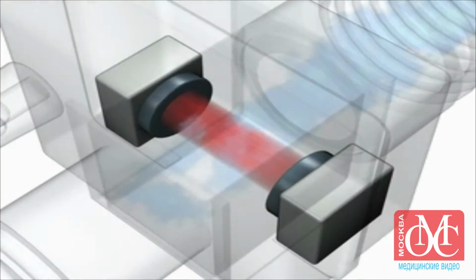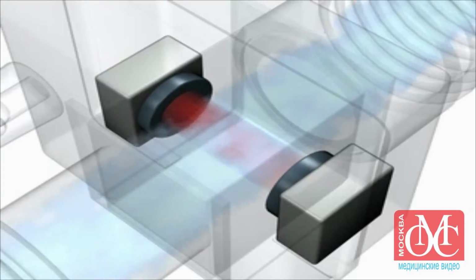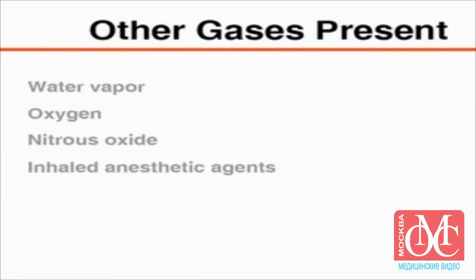Infrared light can be passed through a sample of gas to an infrared detector. As the concentration of carbon dioxide increases, the intensity of the light that reaches the detector decreases. Carbon dioxide gas strongly absorbs infrared light with a wavelength of 4.3 microns. At this wavelength, there is minimal interference from other gases that may also be present, such as water vapor, oxygen, nitrous oxide, and inhaled anesthetic agents.